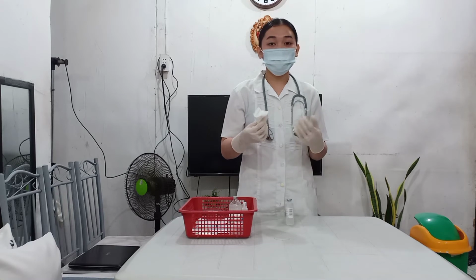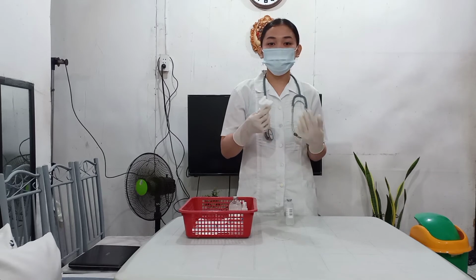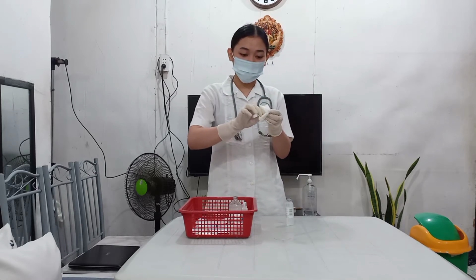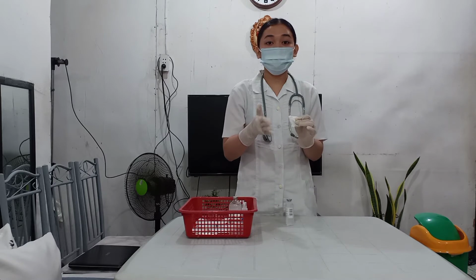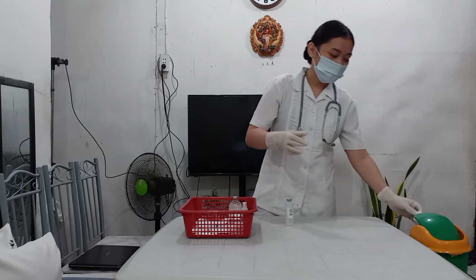Next is to dispose of the top of the ampule in the sharps container. This is to prevent getting cuts from any shattered glass fragments. Make sure to dispose of it properly. So I am going to wrap it with a paper towel and place it. Ideally, it is placed in a sharps bin container, so assuming I am going to place it here.